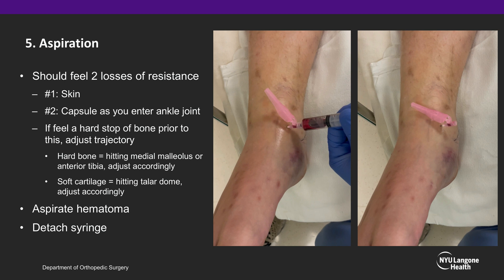If you feel a stop of bone prior to this, adjust your trajectory. If the stop of bone is hard, you are likely hitting the medial malleolus or the anterior tibia and should adjust your trajectory accordingly. If you feel that you are entering soft cartilage, you are likely hitting the talar dome and must also adjust accordingly. Once into the ankle joint, aspirate the hematoma as much as you can, and following that, detach your syringe, leaving the 18-gauge needle in the ankle joint.